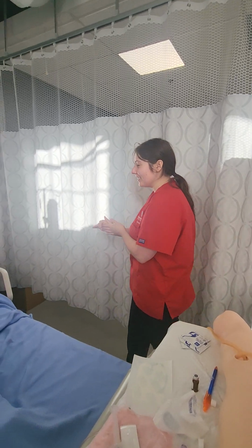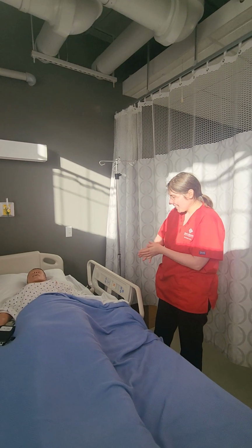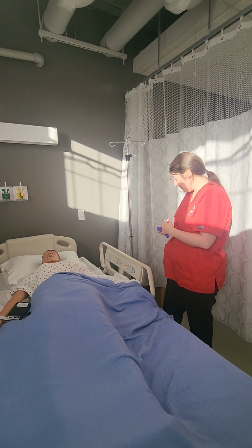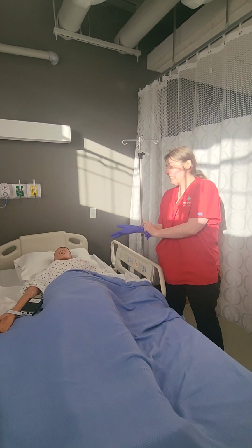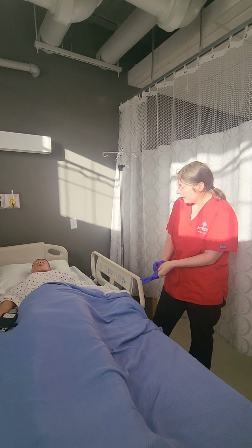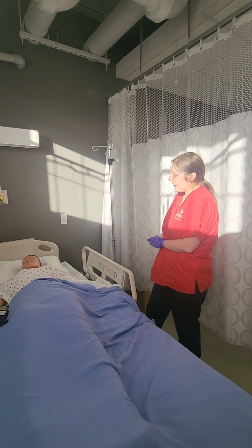Hello, Scott. Can I get your full name and date of birth, please? Scott Mingus, 1998, March 9th. Okay, thank you. I'm just going to double check your little badge there. Okay. Scott Mingus, perfect. Okay, well, Scott, your doctor today has ordered you a peripheral IV as well as morphine injection into that for your pain.